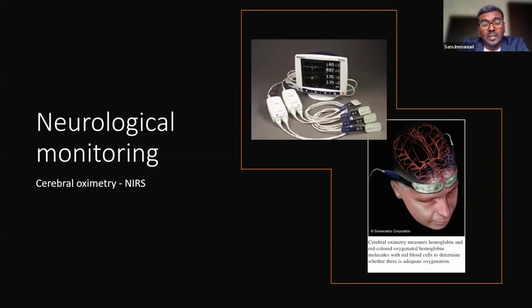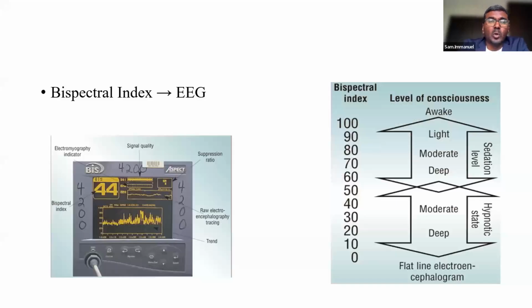And the update here is we have neurological monitoring devices, which are online or inline devices which can be monitored throughout your pump run. And of course, the bispectral index, which also shows the level of anesthesia. We can say what is important. It only tells the level of anesthesia, but the level of anesthesia is decided by the flow rate which you are flowing. So if at all it goes down, it is an indicator for the perfusion or how much we are flowing.